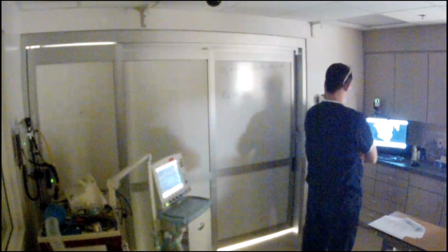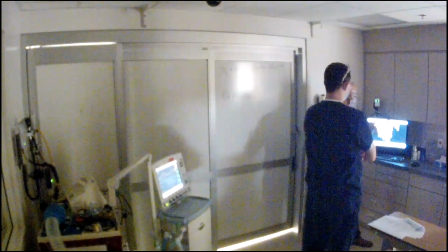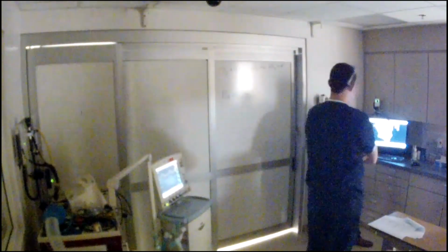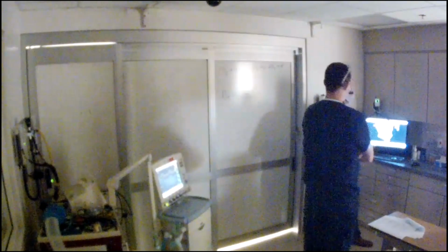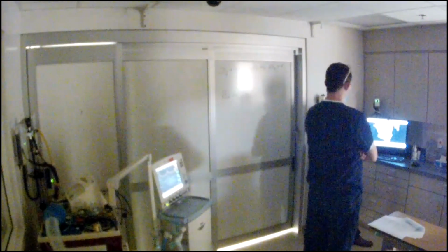Same thing with pneumos. I don't need that chest x-ray. I can do this in the back of an ambulance, or in the ED, faster than I can get a chest x-ray. Take a look, got pleural sliding, good, ruled out pneumos. Or at least big pneumos. He may still have a small pneumo somewhere, but I ruled out the ones that will kill him. So this is a really easy, fast tool. That's another way that we can look at it.